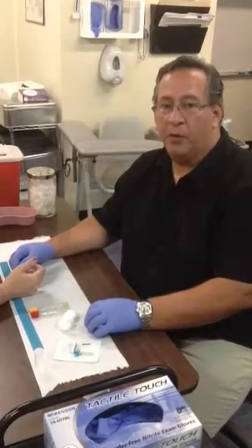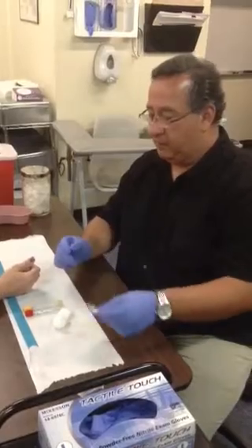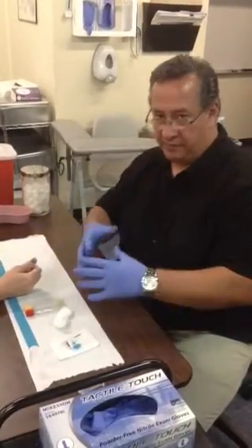In this video, I'm going to show you how to perform a venipuncture using a butterfly needle. Remember to identify your patient, check for allergies, and assemble your supplies.